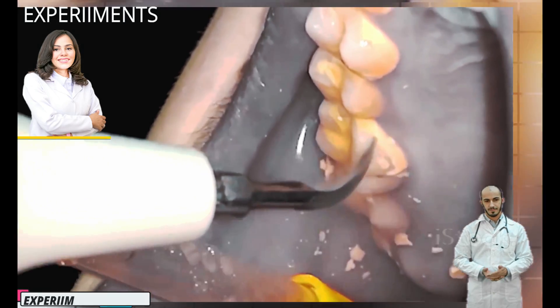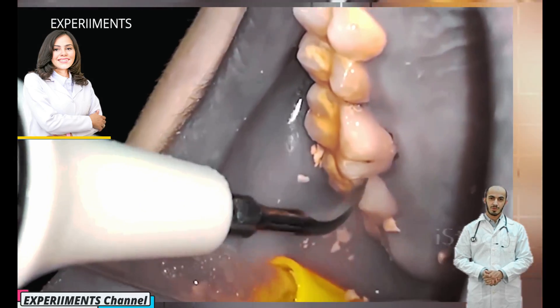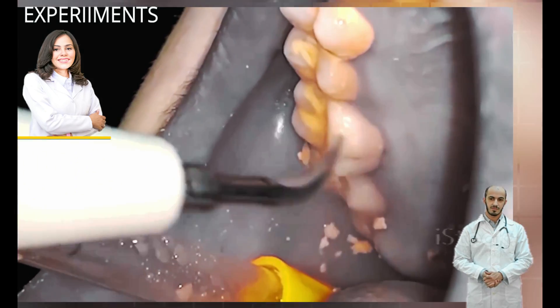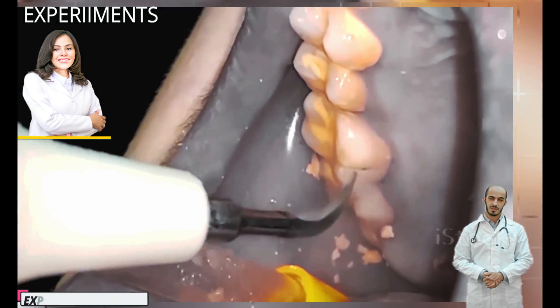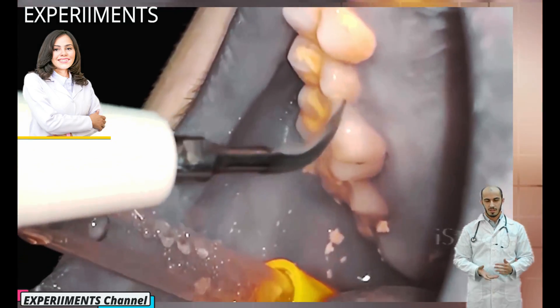So we started examining her. It looks like it's been a while since she had her teeth cleaned, but not everybody in this case has these difficult issues. But for some reason she accumulates tartar very easily. So I'm going to go ahead and show you what this all will look like once the tartar is all removed.